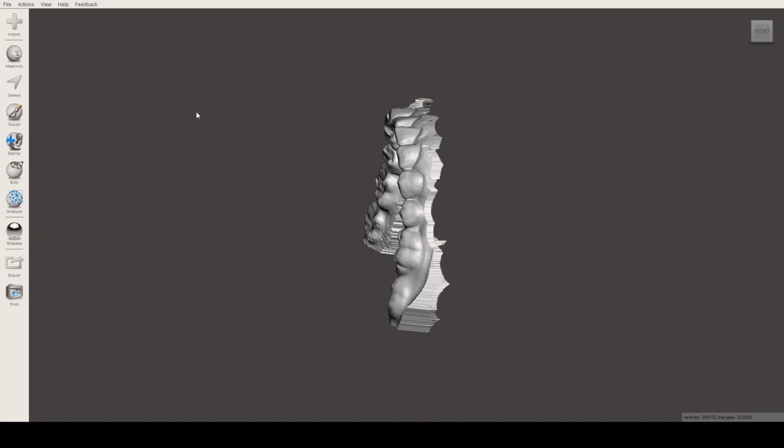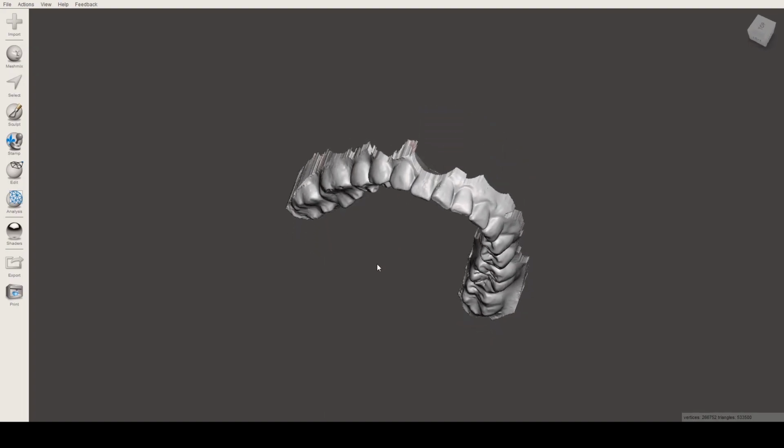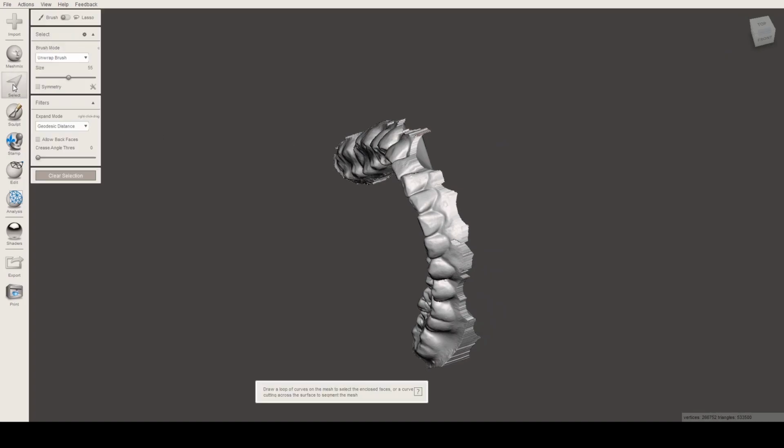That's the front. Now what we want to happen is we want to transform it and we want this to be our front. What we can do is go to our select and just select all.